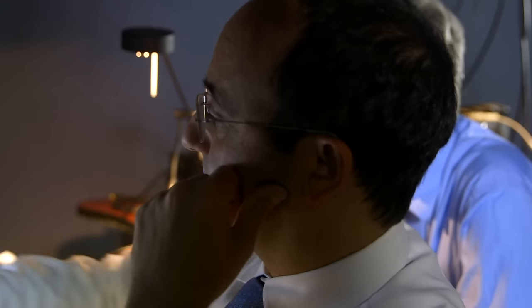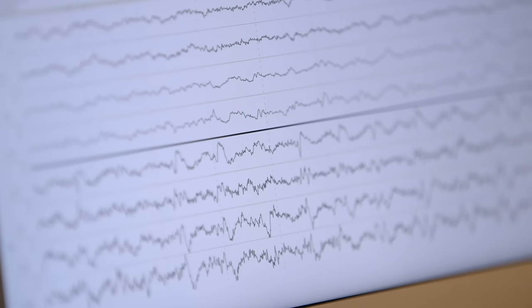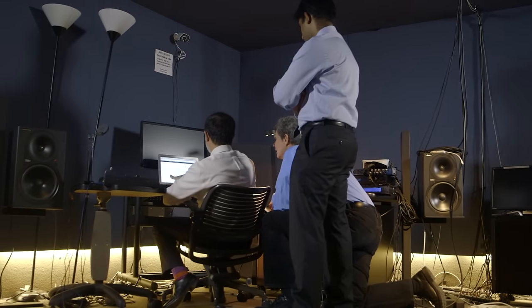The ability of an untrained medical student or nurse to read an EEG is 50%. They're either going to say it is or it isn't there, and it's chance. What we found was that when just listening to the sound of the EEG, medical students could pick up a seizure when there was one 97% of the time.